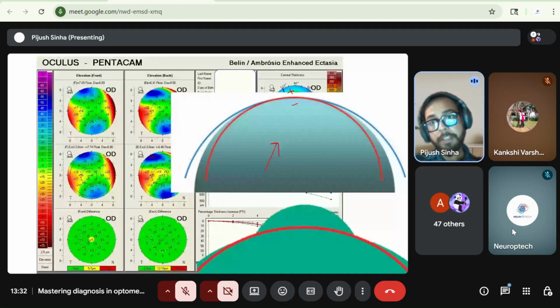But in case of early keratoconus changes or corneal changes, like there is a specific kind like FFKC or early keratoconus changes, then if there is a subtle change or minimal changes to the elevation point, as it is applying a generalized dome shape reference body, it will not be able to catch those subtle changes.